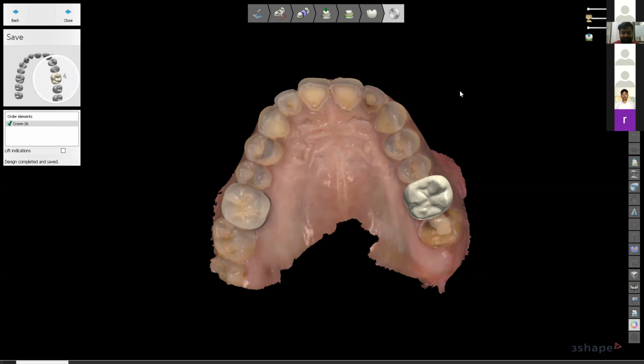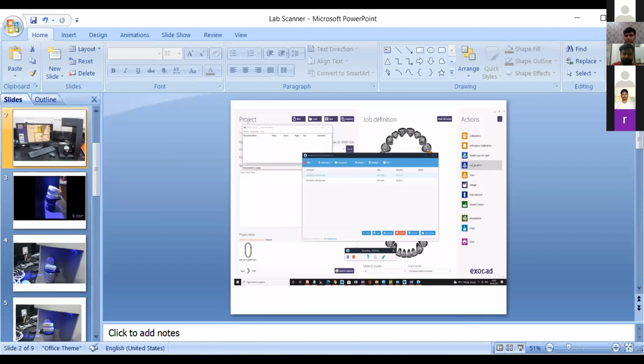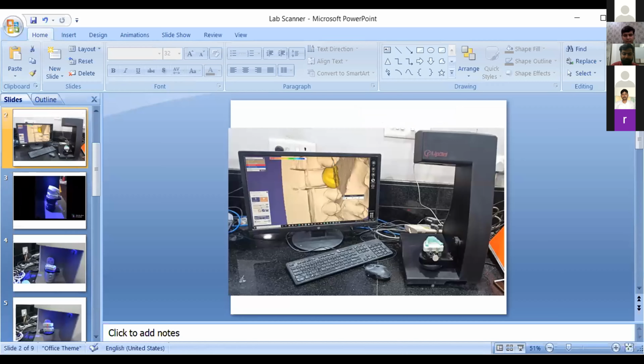Thank you. I think Dr. Sumit wants to show the lab scanner. He has a video. Sumit, you will have to unmute yourself.